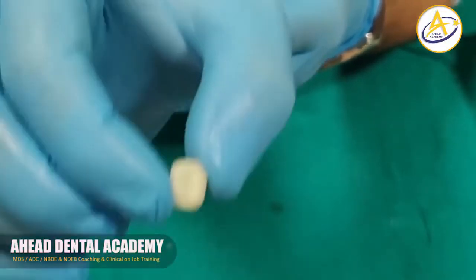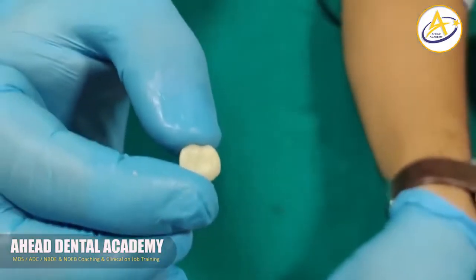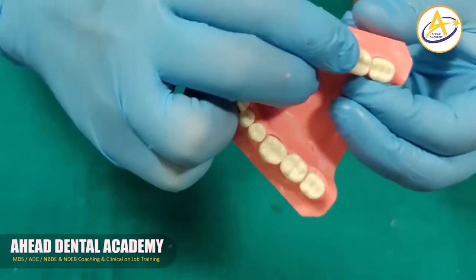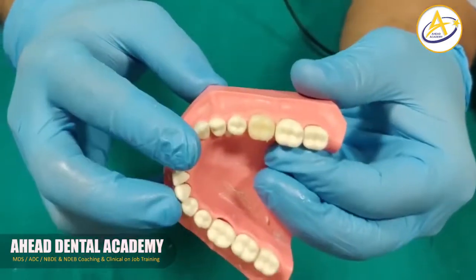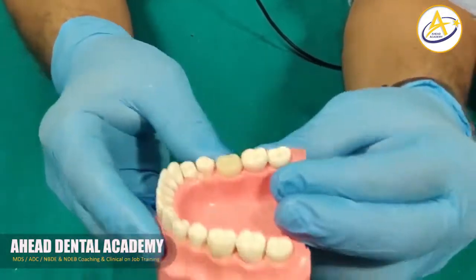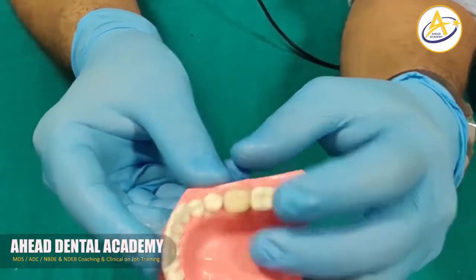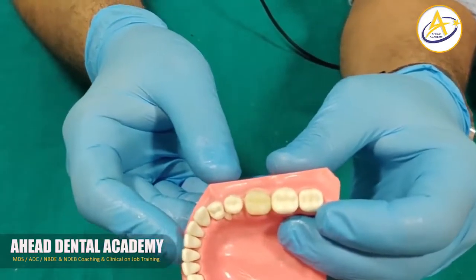This is the final temporary crown that we are able to achieve after the finishing and polishing, and we seat it over our prep and check for marginal accuracy and the fit. So we have been able to achieve the same day temporization. This is a direct method of temporization inside the patient's mouth that we achieve using a putty index and this acrylate resin.